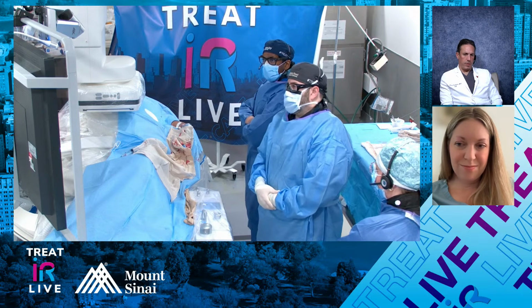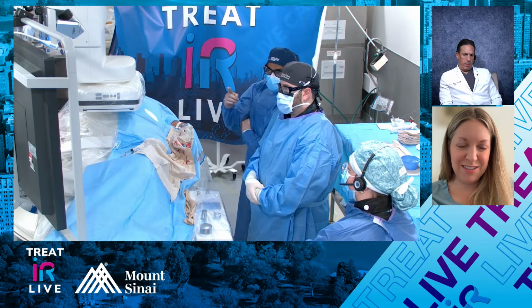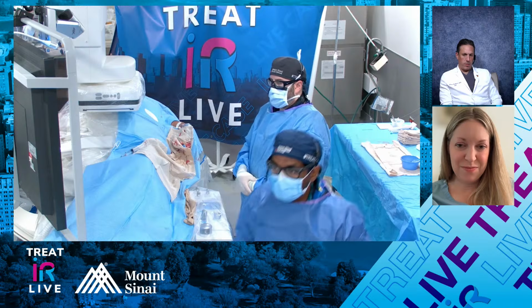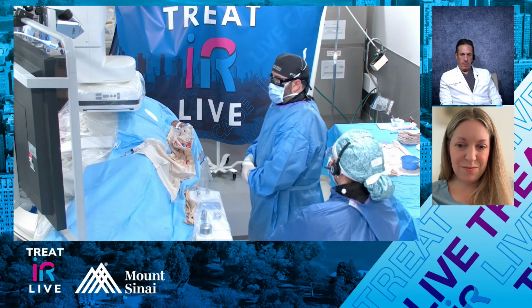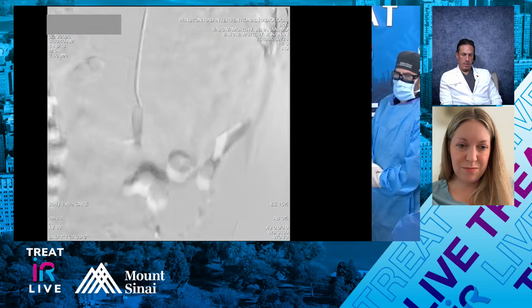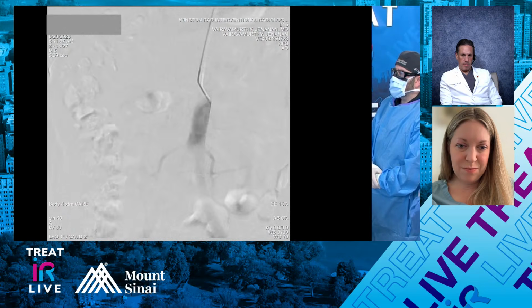This is a great result, Jay. Awesome job, really. Well, any last minute comments from Dan or Jay or Jesse before we're getting close to the hour mark here? Yeah, we were going to try to show you that initial run. Can you hang out with us for just a second? Next one.